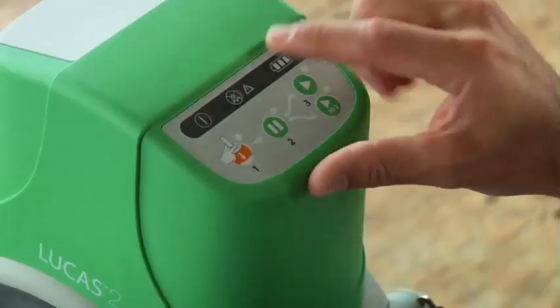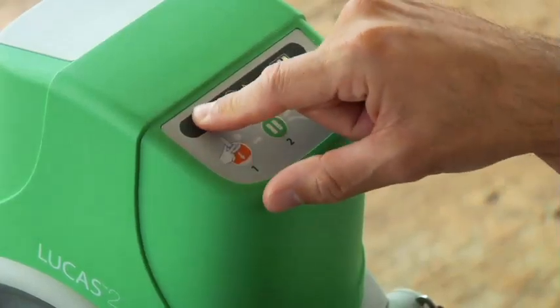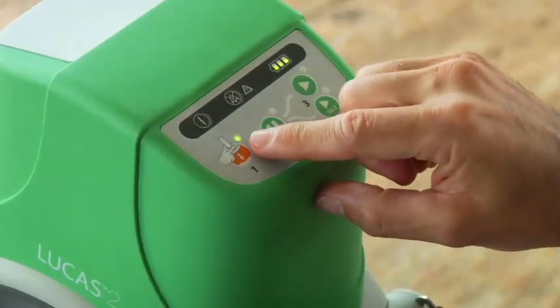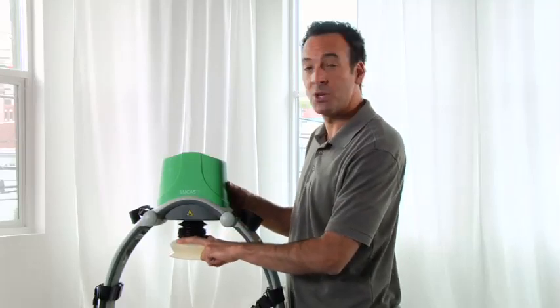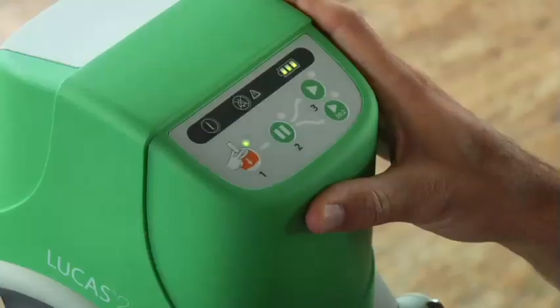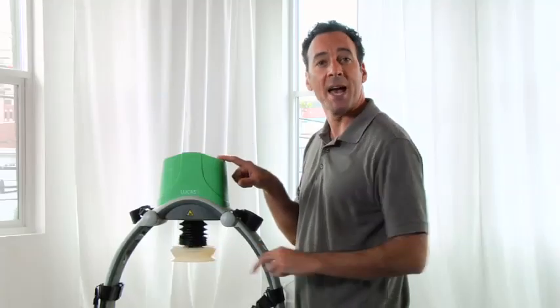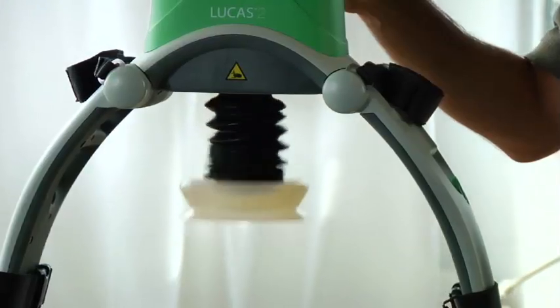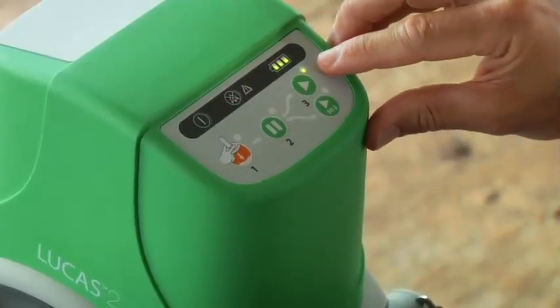Lucas is very simple. This is the control panel. Here's the on-off button — push it down for one full second to power on or off. When the green LED next to the adjust button lights up, you can adjust the suction cup to the correct start position for each patient. Use the pause button to set the start position for the suction cup. Press the active button for continuous compressions.